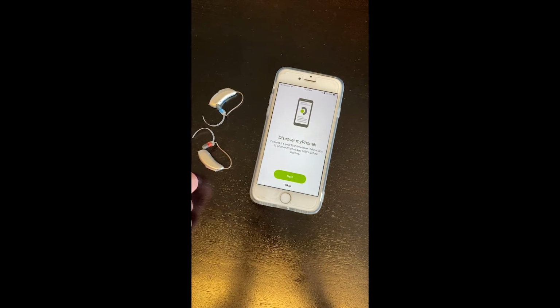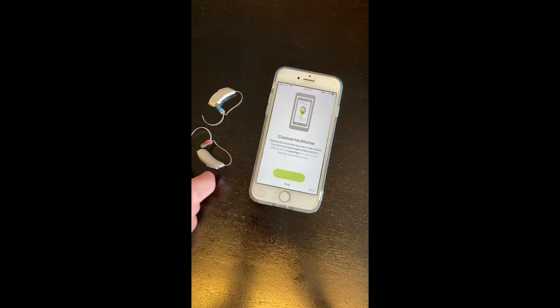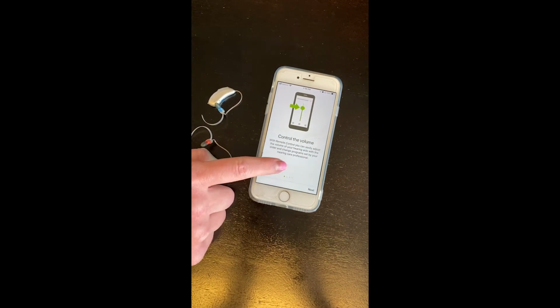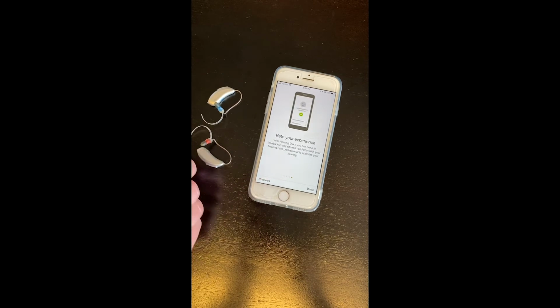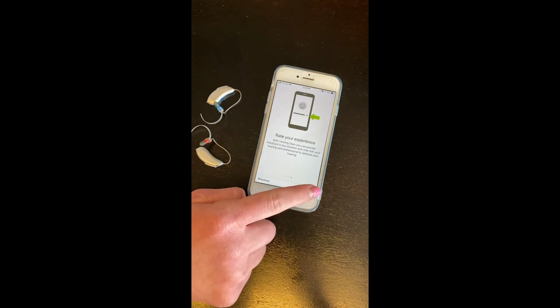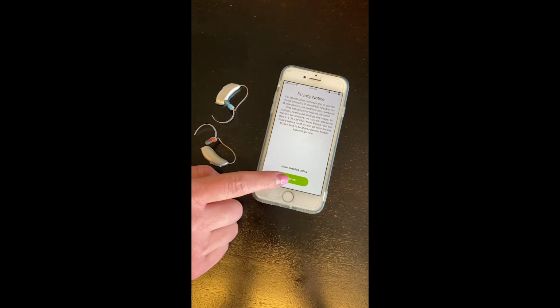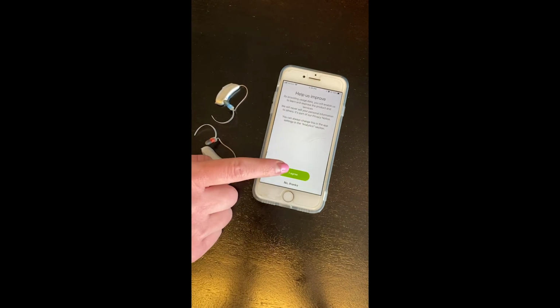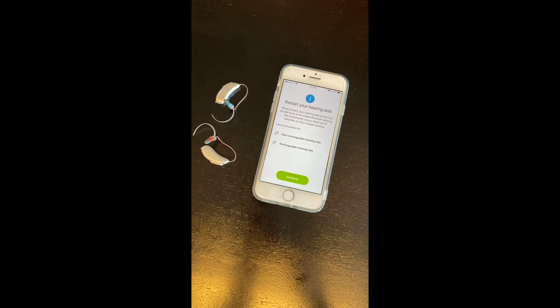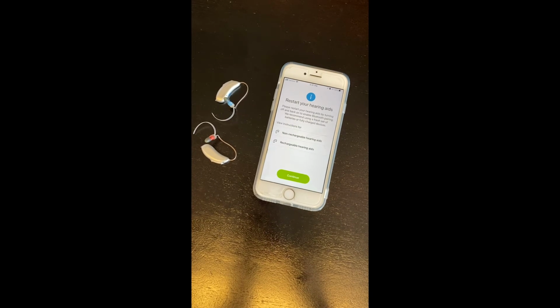It says you can discover My Phonak. It says it seems it's your first time here. You could always press next and we could learn a little bit more about it. We're going to do that today by learning all about it. I would recommend reading through these though before moving on. And then you press done. It's going to give you a privacy notice which you want to accept, and then you want to agree to that. Okay, so it's going to teach you how to connect your hearing aids, which you're only going to want to do the first time that you connect to this app.